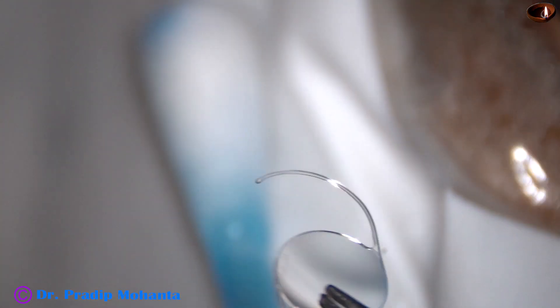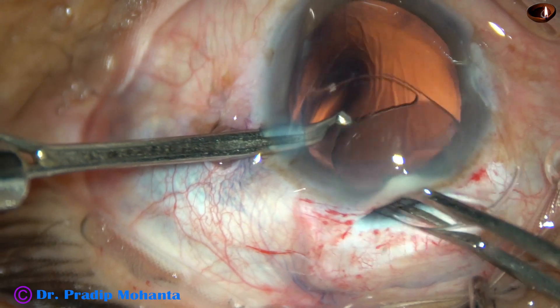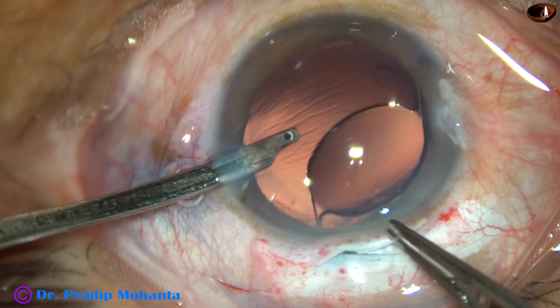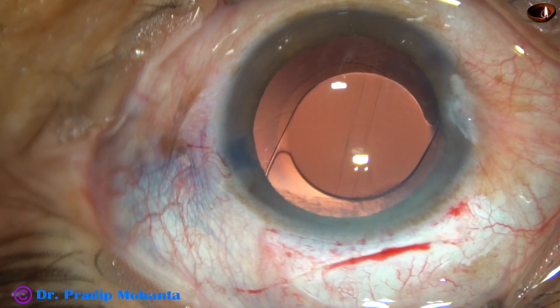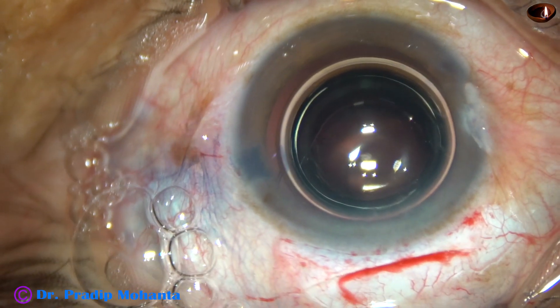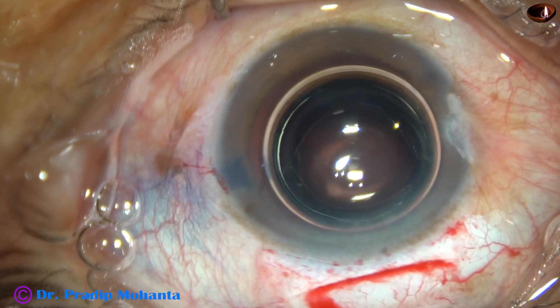And this is the lens. It is always a good idea to wash the PMMA intraocular lens with Ringer's lactate on both surfaces. And then this is hydro implantation — this is a bit tricky for beginners. You can always use a viscoelastic substance for implantation of the intraocular lens. The anterior chamber was shallow so I have injected an air bubble to buy some time. This is moxifloxacin.